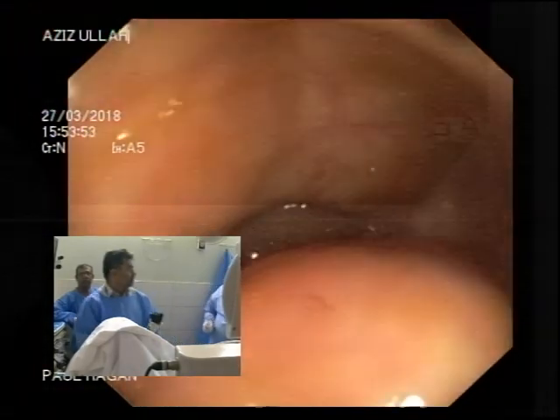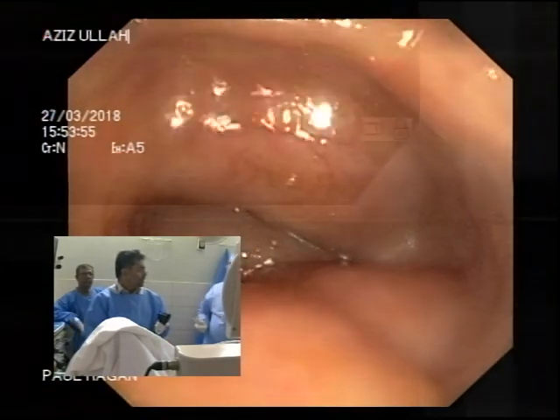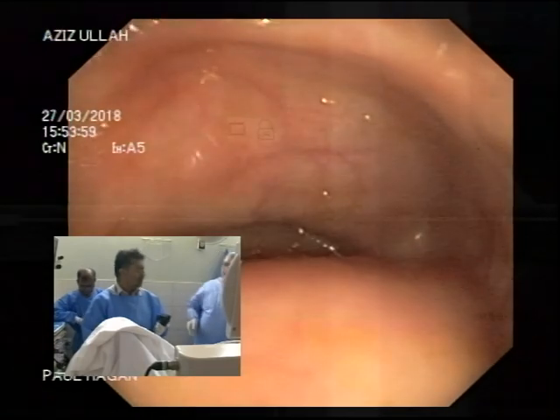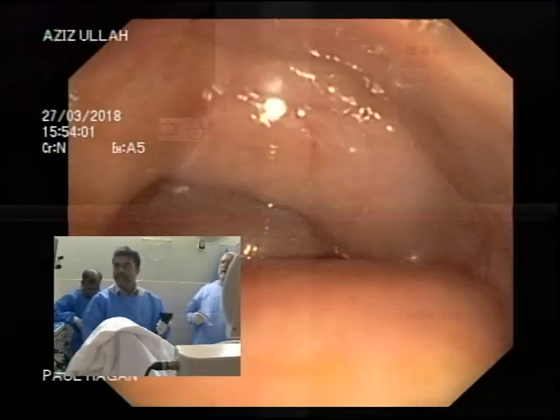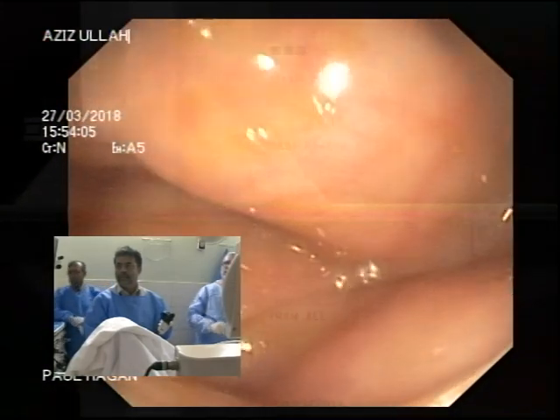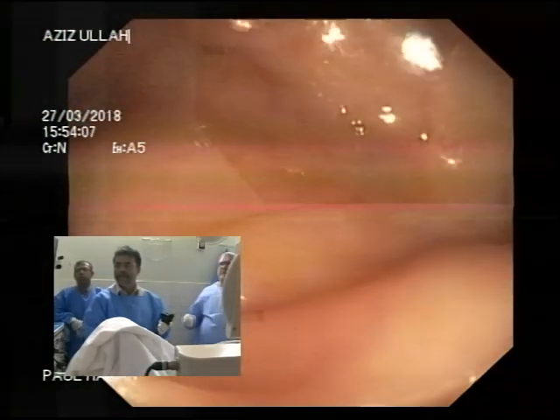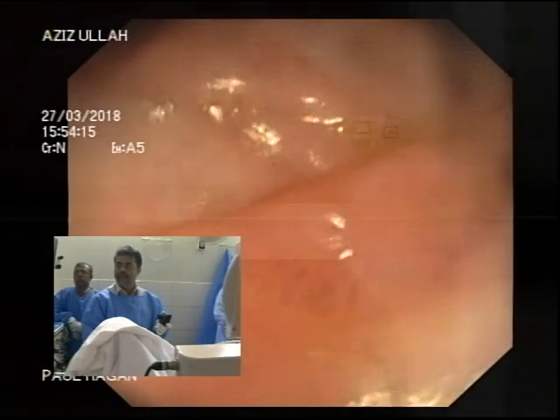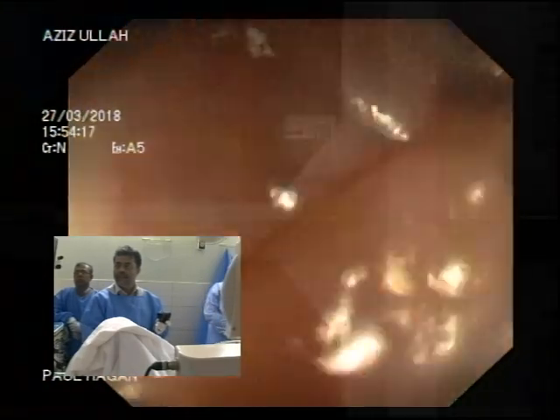So he's comfortable. So, the old algorithm is advance till you get discomfort or pain, or it's unsafe to do so. But what I was showing is go forward, come back. Go forward, not completely back, but go forward, come back. A little bit of air. Go forward, come back. Good. A little bit of air. Go forward, come back. Great stuff.